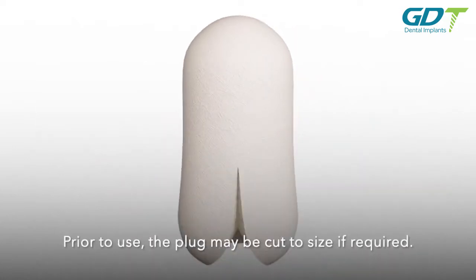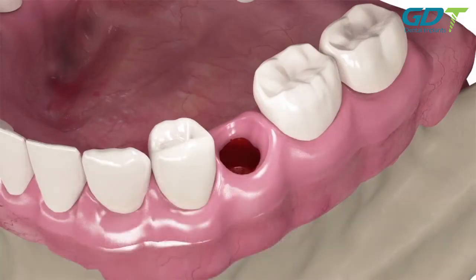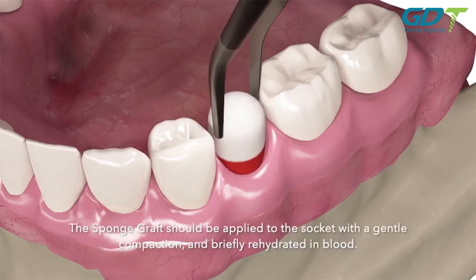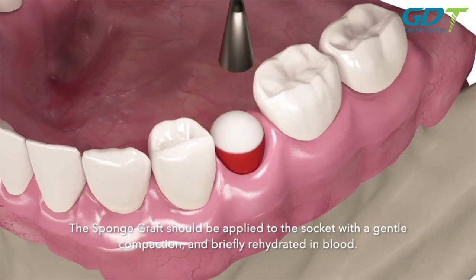Prior to use, the plug may be cut to size if required. The sponge graft should be applied to the socket with a gentle compaction and briefly rehydrated in blood.